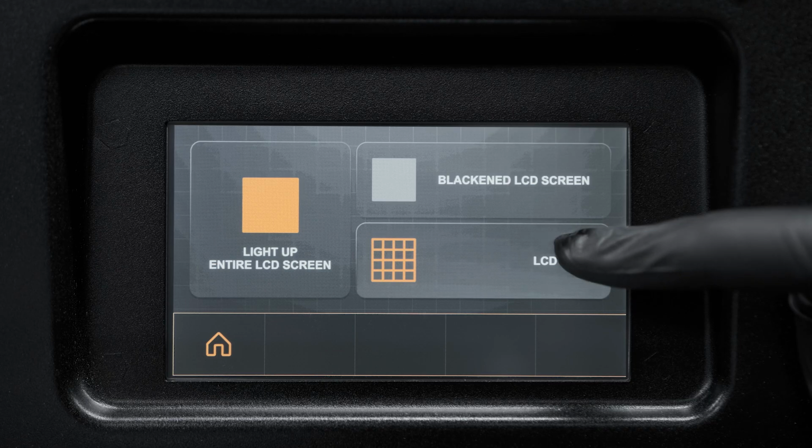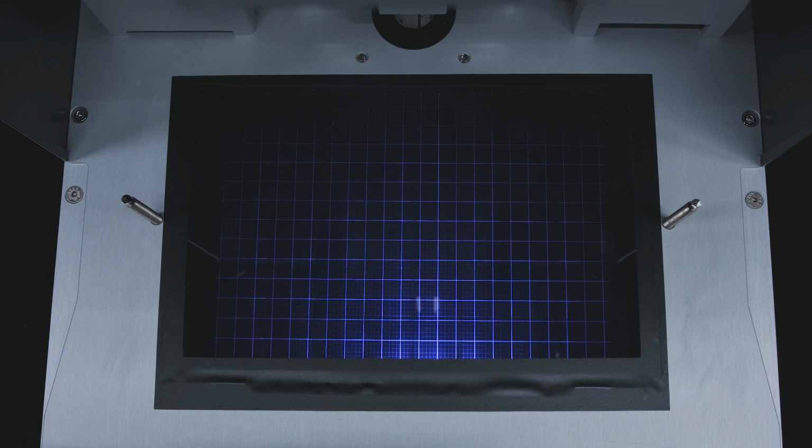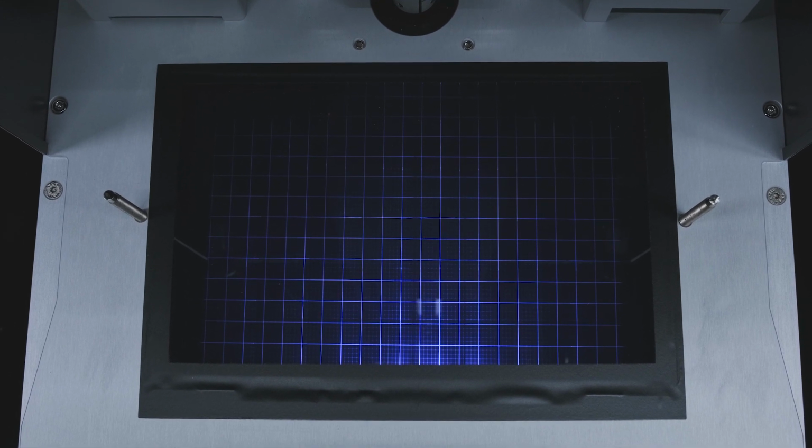Select LCD grid, and a bright blue grid appears on the LCD. At this point, check if all grid lines displayed are visible and regular.